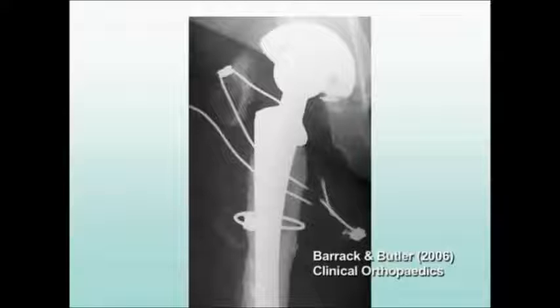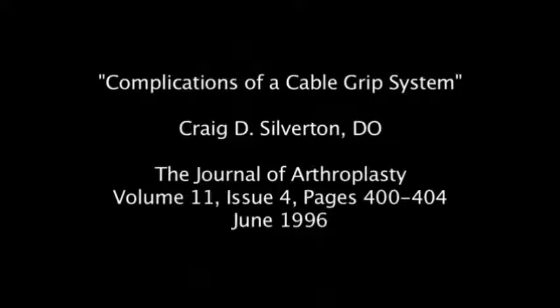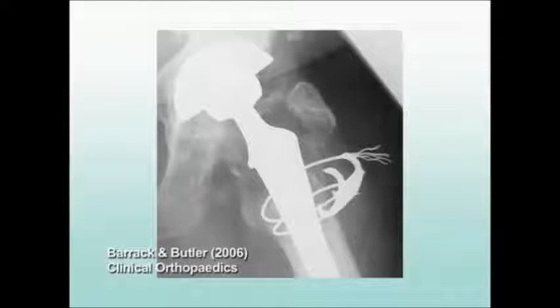Silverton et al. reported in the Journal of Arthroplasty in 1996 on a series of patients receiving metal cable grip assemblies for trochanteric fixation, in which 25% of patients experienced trochanteric non-union, and, in 88% of these cases, fraying and fragmentation of the cable were present. Other published reports have cited cable fragmentation and breakage rates ranging anywhere from 3 to 33%.